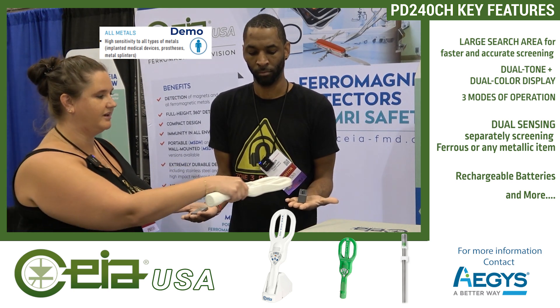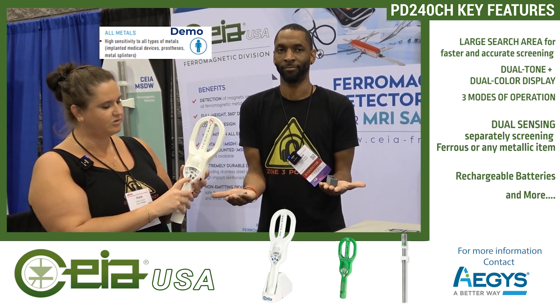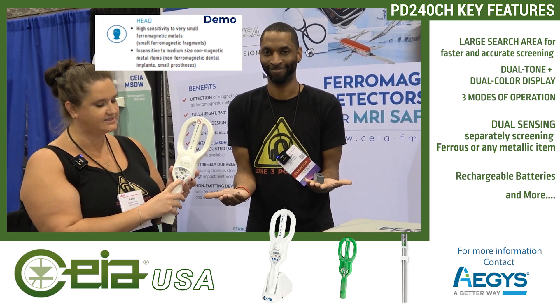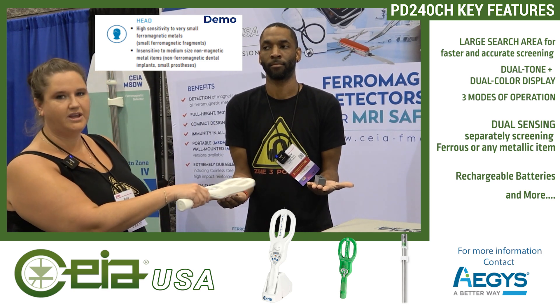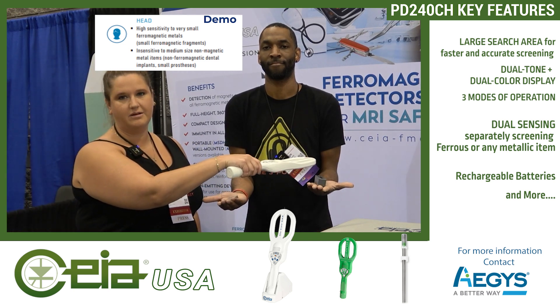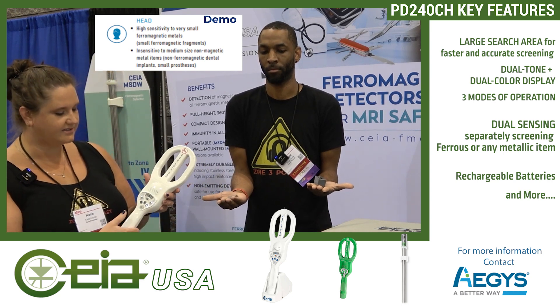With the hip, it also goes off. Now if I change the setting, there are two ferrous modes: a broad-spectrum ferrous and a more increased-strength ferrous. I'm going to go over the BB — it does go off. Going over the titanium hip — it's okay to scan. Those are the different settings that are available.